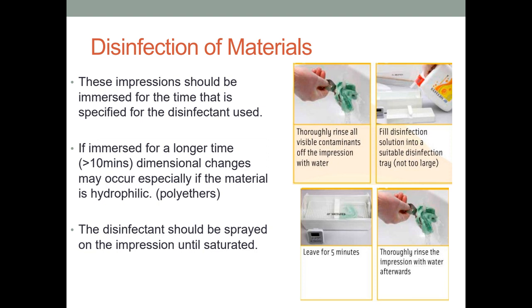The reason is that polyether is a hydrophilic material. If we keep it in a disinfectant for more than 10 minutes, there are more chances that the material will absorb some of the liquid from the disinfectant, and it can change its dimension. That's why it is very important to understand this part: for disinfection we need to read the instructions for the disinfectant that is compatible with that particular material.